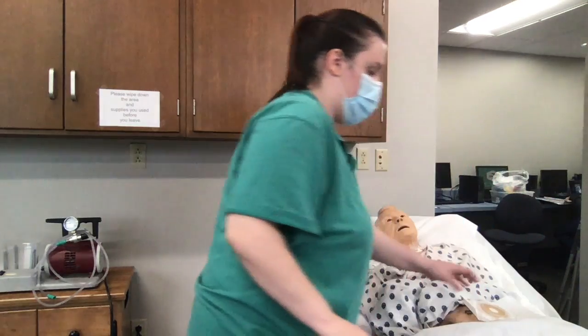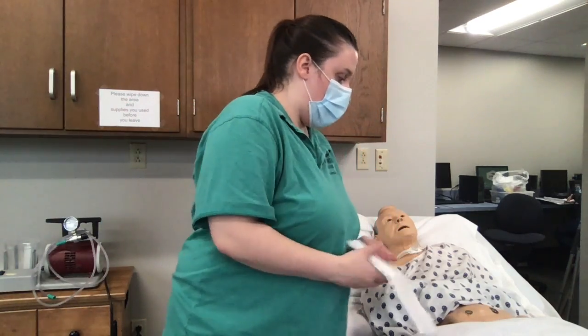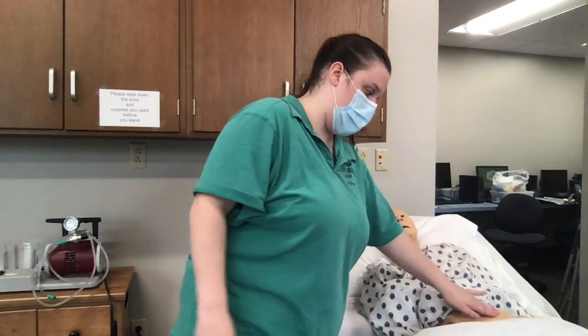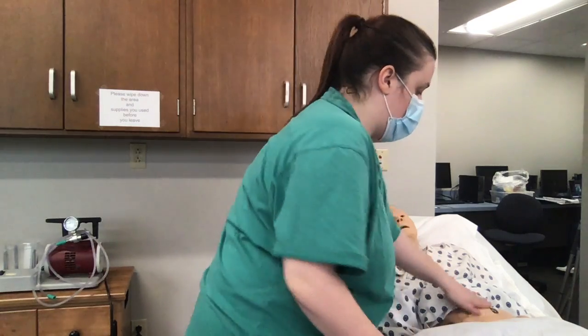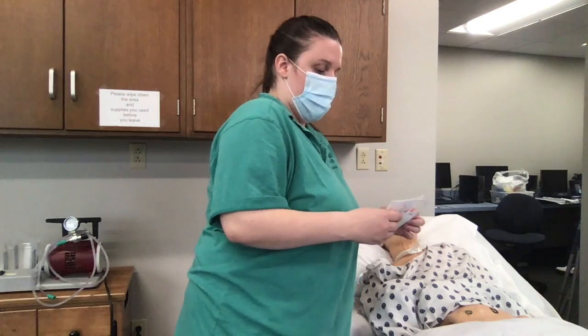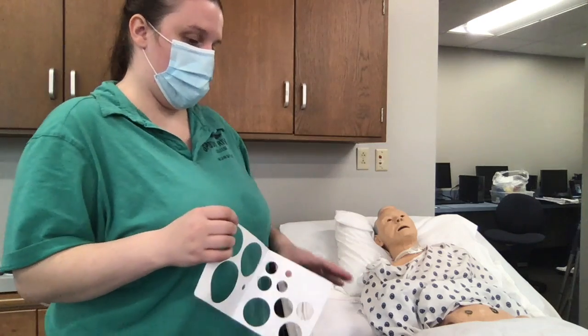And then I can remove my irrigation bag. And at this point, I will be removing my old wafer completely. And this is when I'm going to check my stoma site. I am going to make sure that I'm noting any kind of redness, drainage, anything like that, and recording it. And then once that's done, I can clean around it. I can take a warm washcloth, I can clean around that, and then I can move forward with measuring it and applying a new wafer and bag.